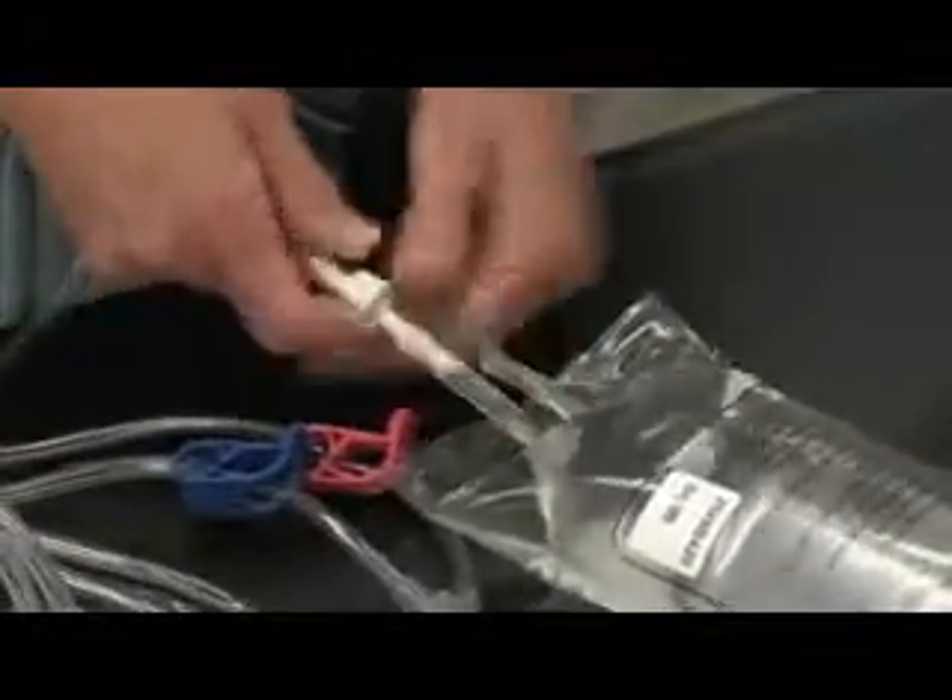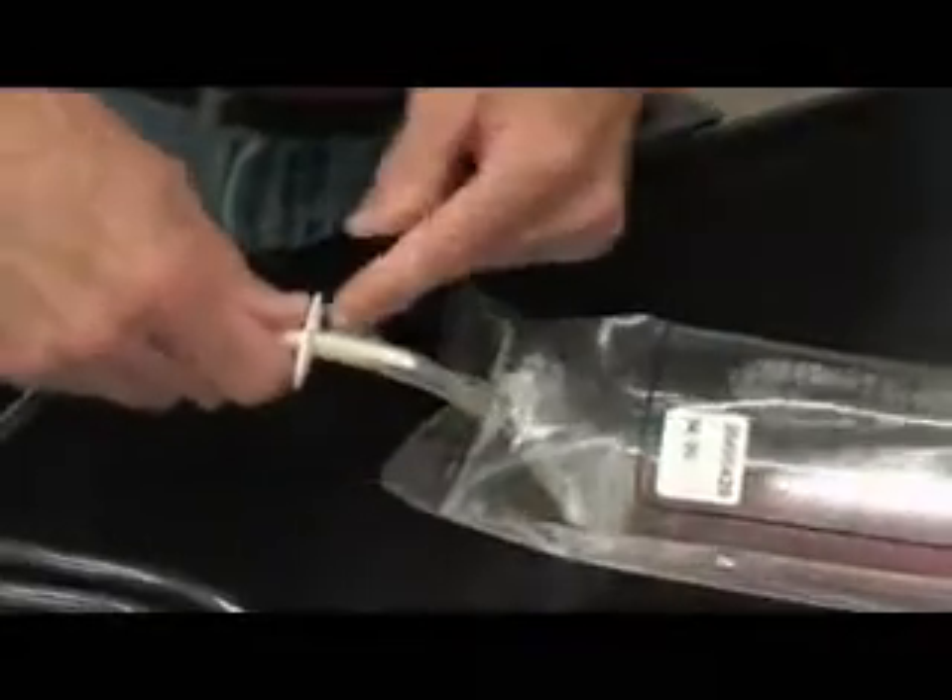It's a push and twist action — push, continue, right there. So it's all the way in.